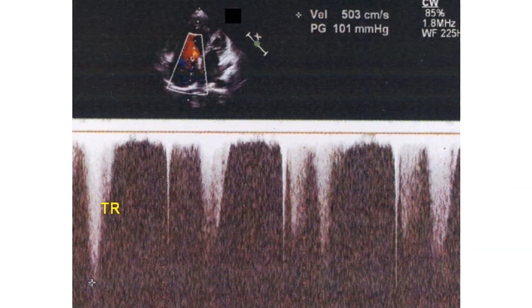Tricuspid regurgitation gradient in severe pulmonary hypertension measures 101 mmHg. The TR jet is incompletely visualized. Estimated right ventricular systolic pressure is obtained by adding the right atrial pressure — taken nominally as 10 mmHg — to this value. As the velocity is very high, interrogation is performed using continuous wave Doppler.